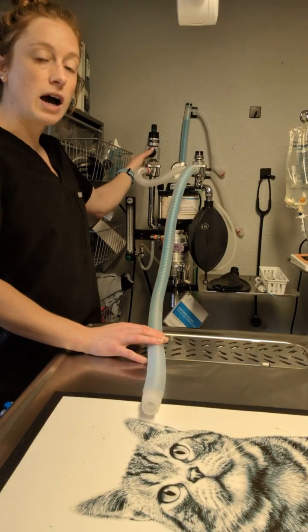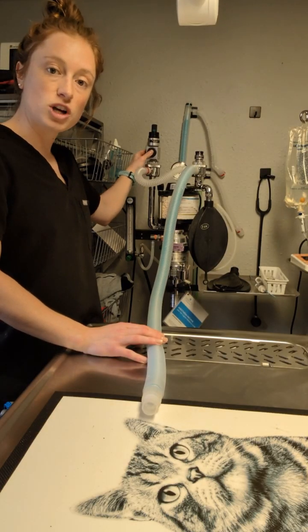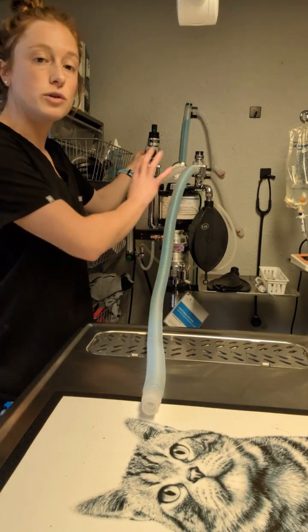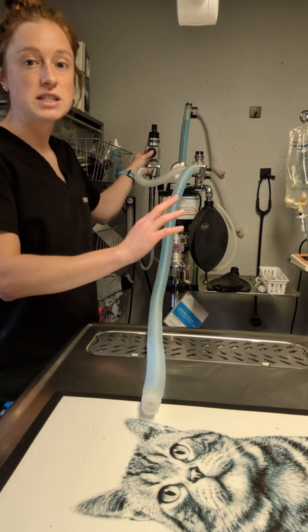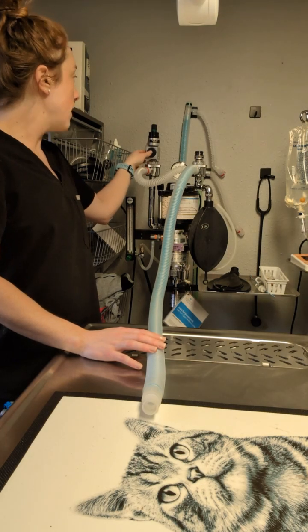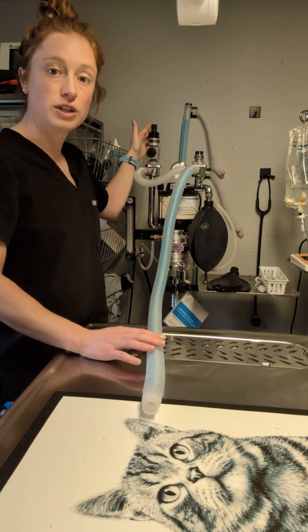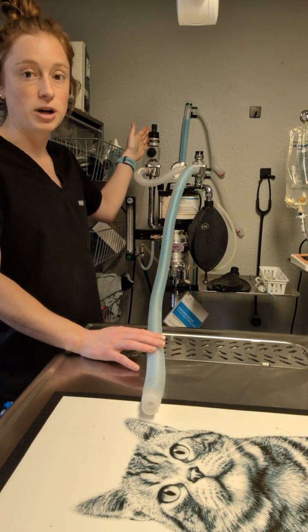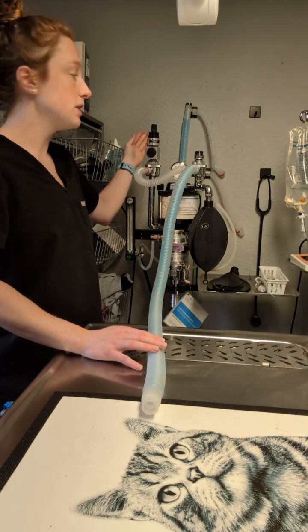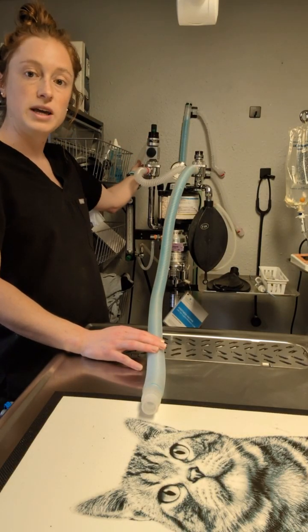We have our APL occlusion button here. If we push on this button, that will close the system and not allow any of the gas to escape. This can help test for leaks. And then we have our pop-off valve at the top in case the pressure is growing too great. This will open automatically in order to relieve any pressure that would go to the patient normally. And then after that, it will go to our exhale tube in the back.